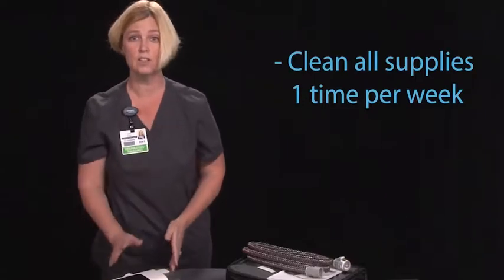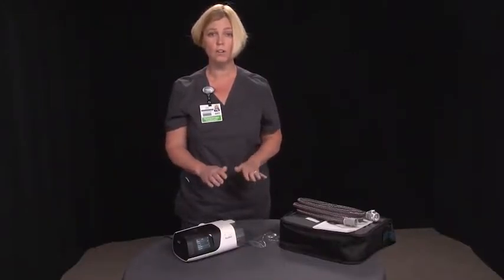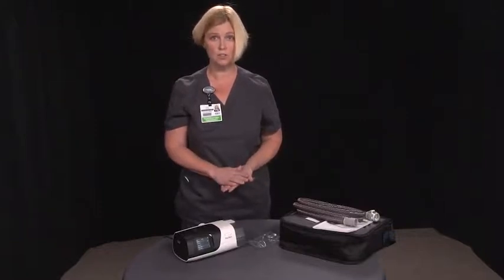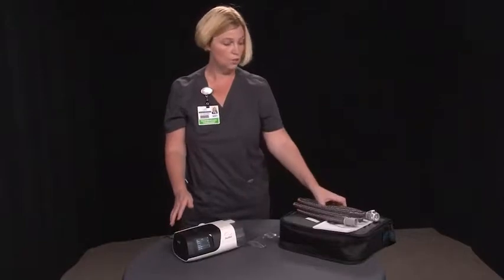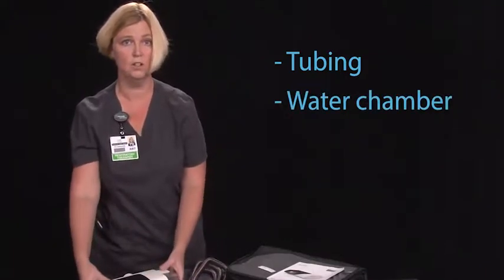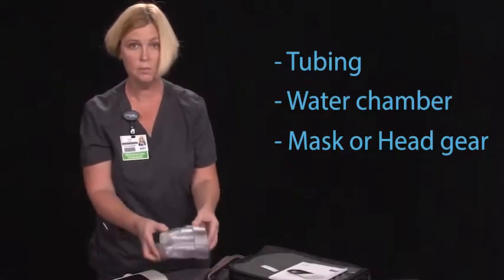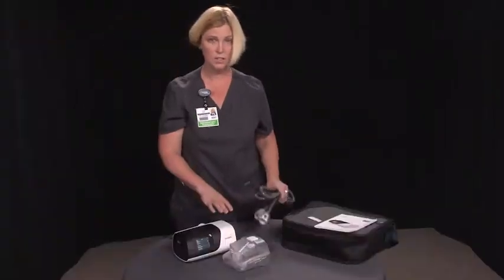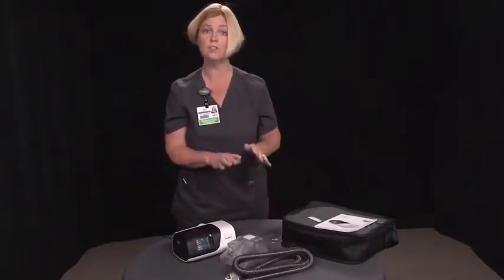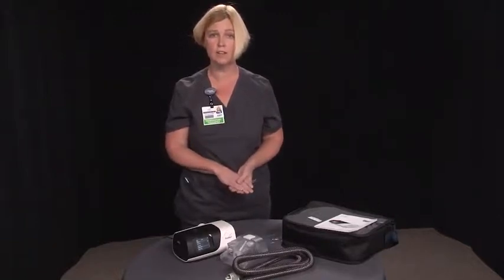The one thing that you're going to do once a week is you're going to clean all of your supplies. So to clean your supplies, you just want to get a sink or a basin full of warm water and just a couple drops of mild dish soap. What you're going to include when you clean is your tubing, your water chamber, and whatever mask or headgear that you have chosen. You will simply submerge all of these items into the water. You can use tap water for this cleaning process. Let it soak for about 5 to 10 minutes.